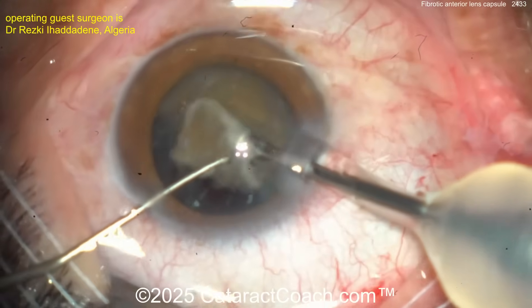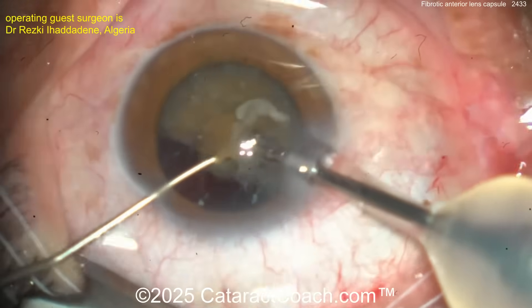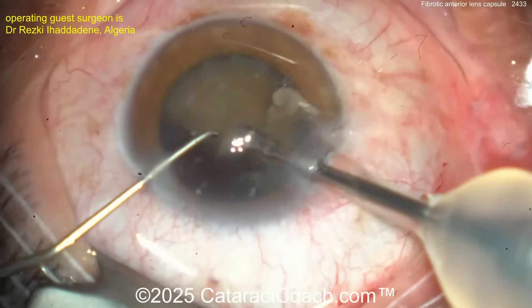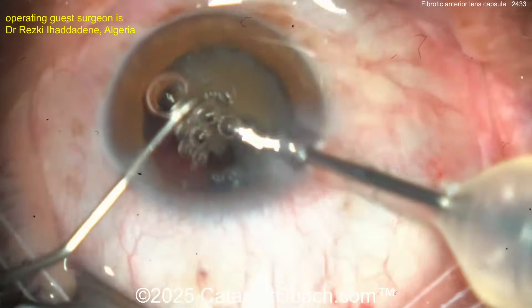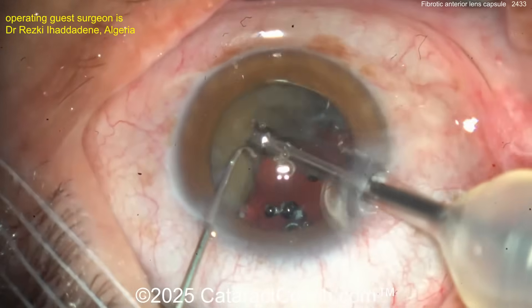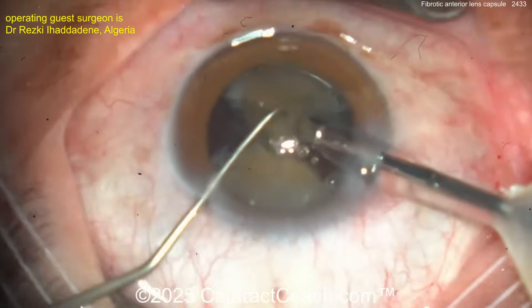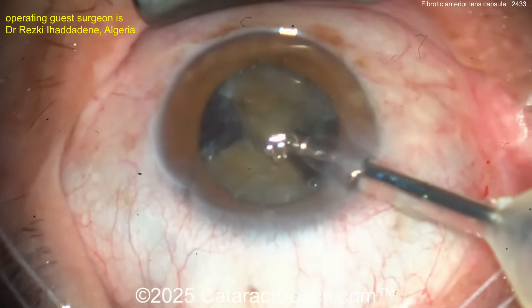Now taking these pieces down — how happy is this patient going to be! Don't you love a fun challenge case? It keeps the day interesting. Now you've got half a nucleus out. There's the other half in the capsular bag — get it rotated around. Buzz buzz buzz — and there's the chop again. Very handy with the vertical chopper.